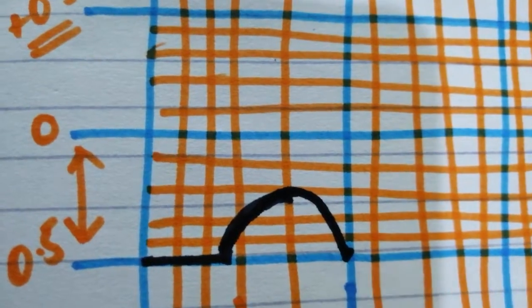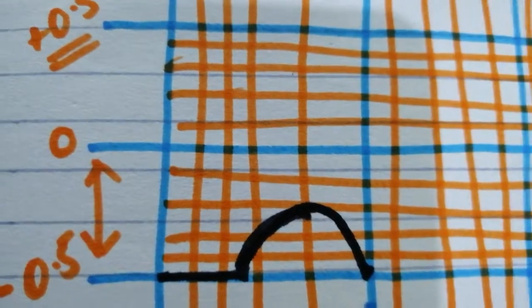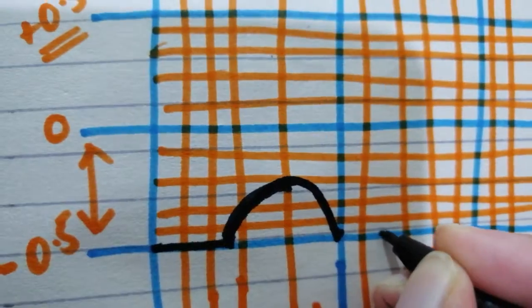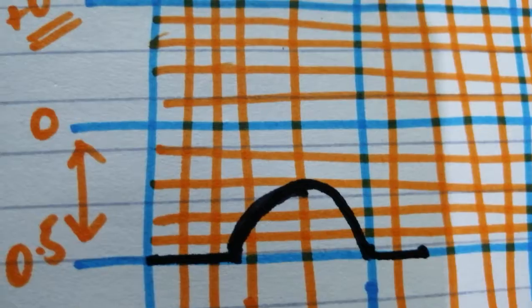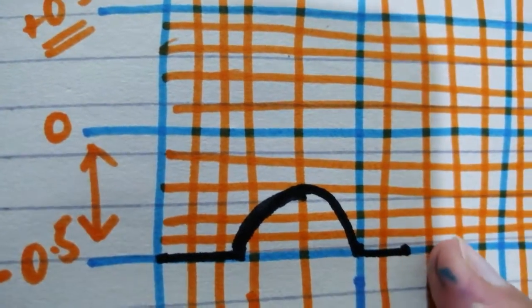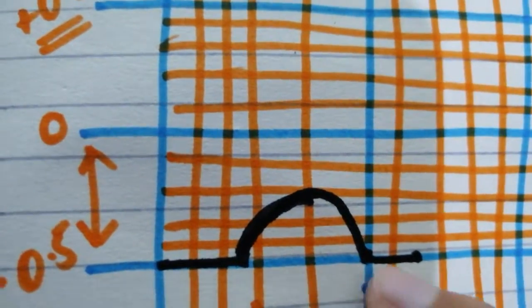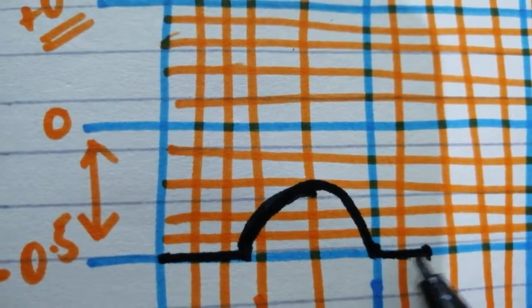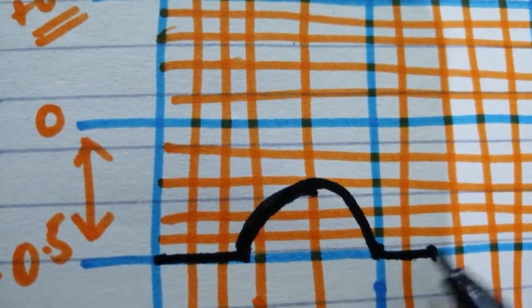time period the atria will be completely depolarized and the ventricles will be completely polarized, so there won't be any potential difference, and this tends to last for about 0.02 to 0.06 seconds. I'll go for 0.06. This is a normal interval. However, if it crosses 0.1 seconds, this period of non-deflection, that's abnormal, and that means something. So what does this represent and what is it called?